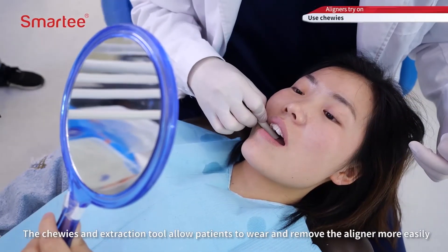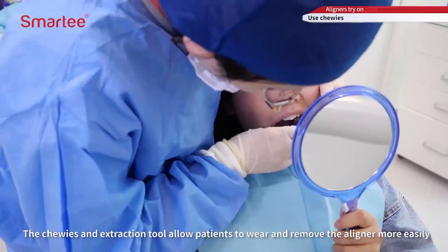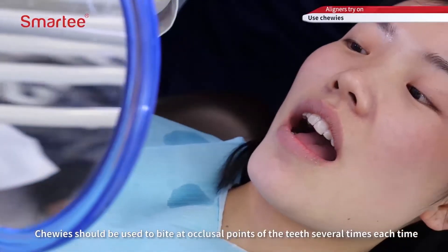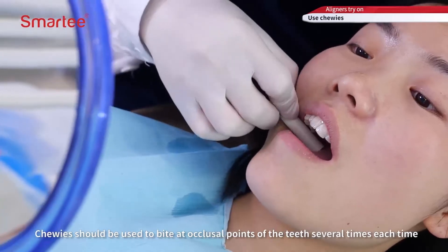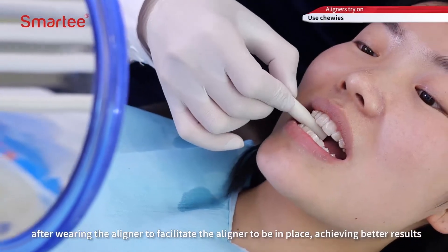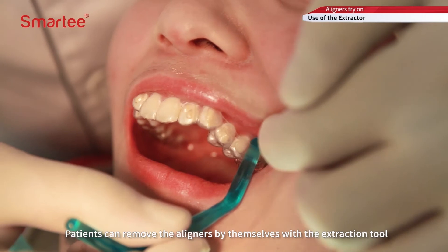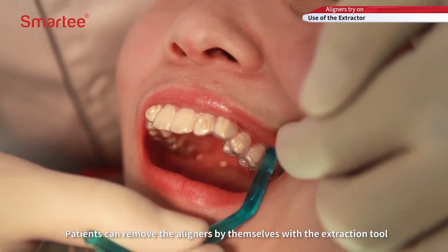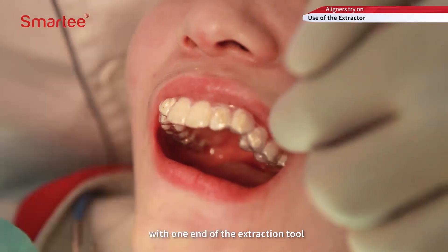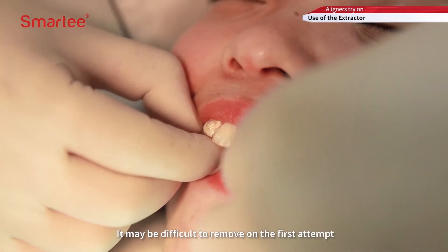Chewies and an extraction tool allow patients to wear and remove the aligner more easily. Chewies should be used to bite at occlusal points at the teeth several times each time after wearing the aligner, to facilitate the aligner to be in place for better results. Patients can remove the aligners by themselves with the extraction tool by hooking the edge of the aligner at the posterior teeth area. It may be difficult to remove on the first attempt, but repeated practice will make it easier.